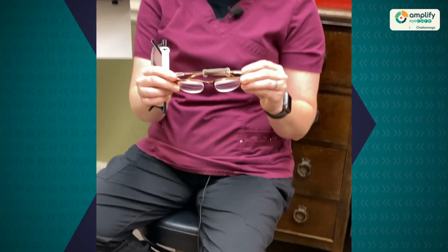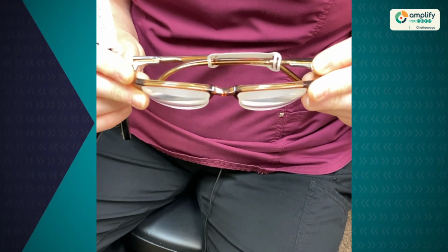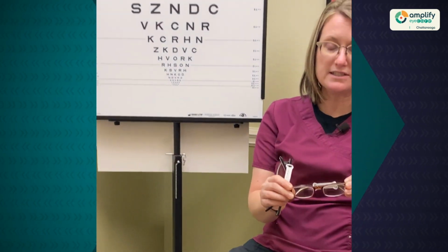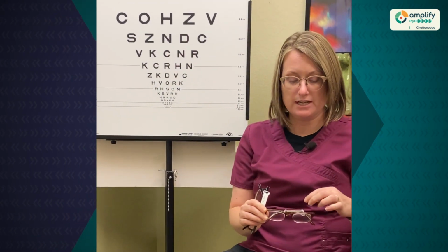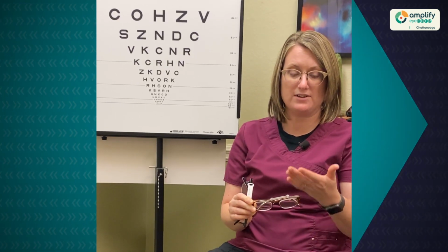So they're usually going to start at a +4, and they may go +4, +5, +7, 10, 12. And when you get to this level of magnification, then you add in base-in prism. And so what the prism does is alleviate the eye strain that's associated with the patient having to hold the material so close to their face.